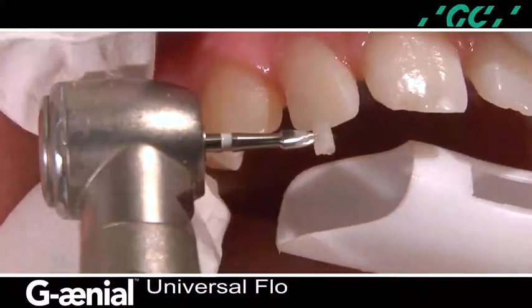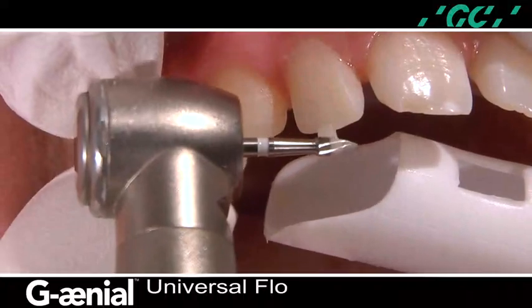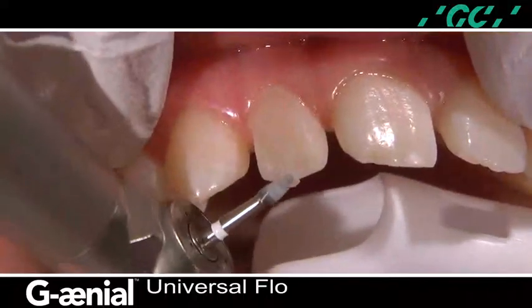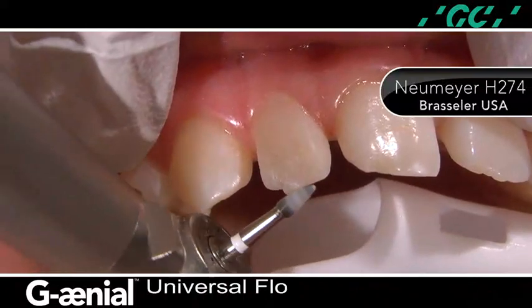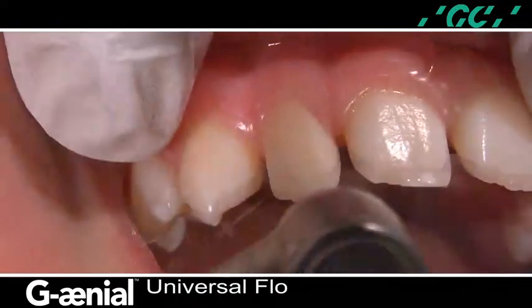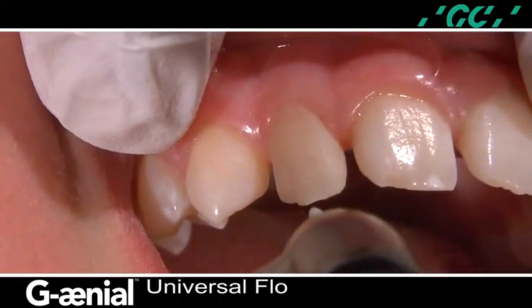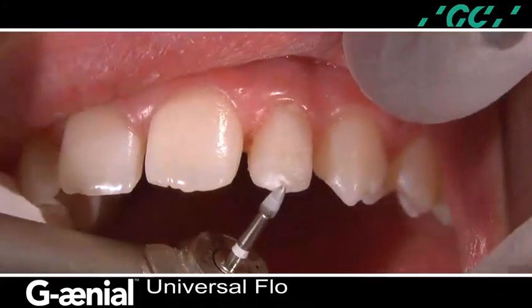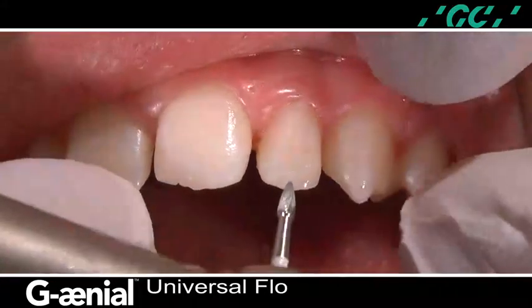The composite sprue is removed and the incisal edges of the laterals are contoured with a 30-fluted pyramidal-shaped finishing burr, an H274 by Brasseler. The shape of this instrument facilitates finishing because it follows the anatomical contours of the facial and lingual of the incisors.